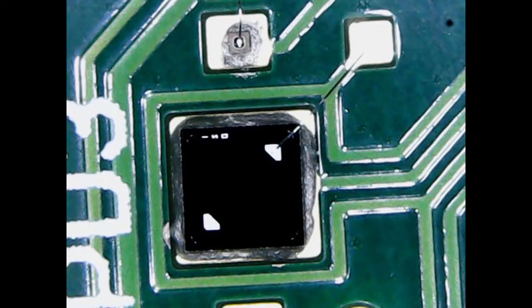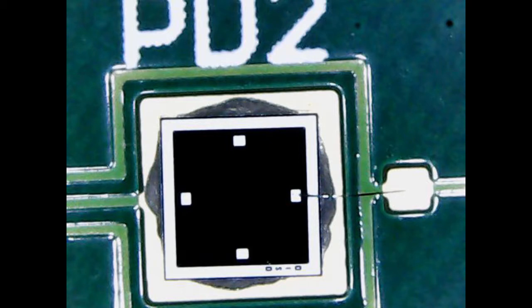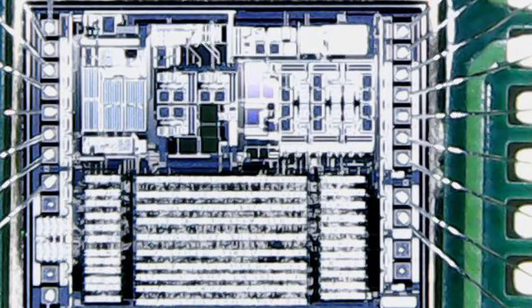These are some close-up shots of the three ICs that were previously described on the board, and not much could be seen. They look black. You could see differences between them, but not much else could be picked up. Then there is the central chip on the back there that was not potted. Again, amazing. Broader view, and then a little zoomed in view where you could see the different sections in the silicon. It's amazing that it's a clear housing, and you could see all the little modules and different sections. Not that I could tell what they are, but it still is better than any decapping that I've ever done before, and this came pre-open like that. You could see all the little contacts, the gold contacts, and how the wires come out. Interesting to look at. Just amazing that they left it like that.